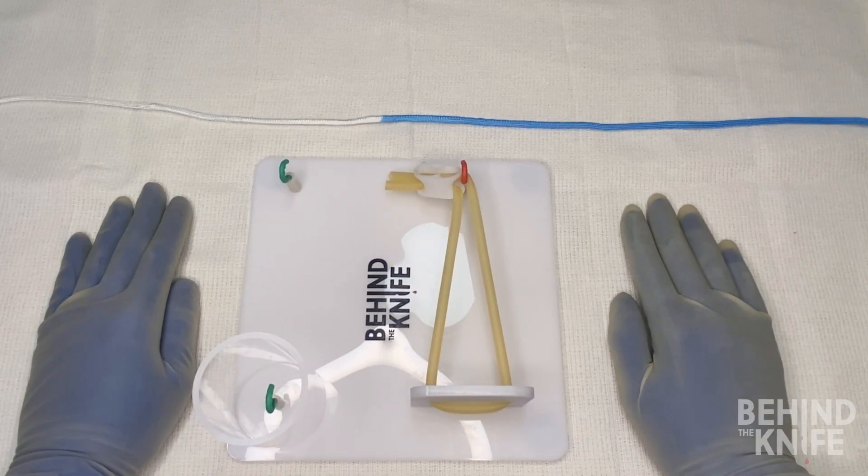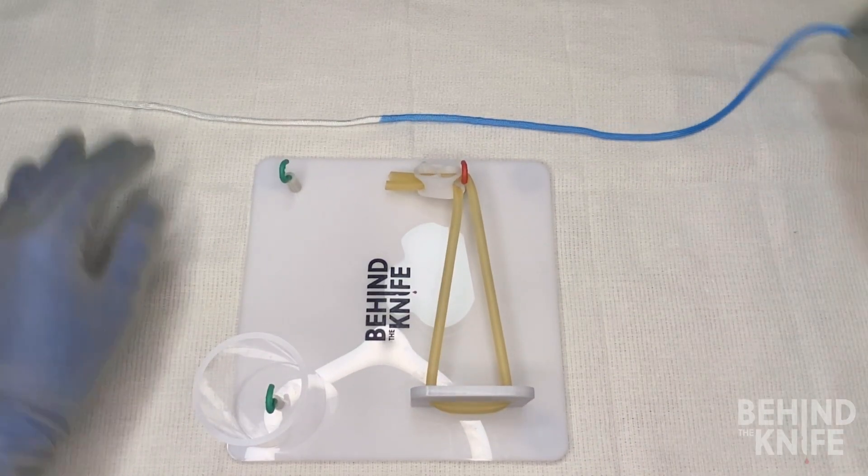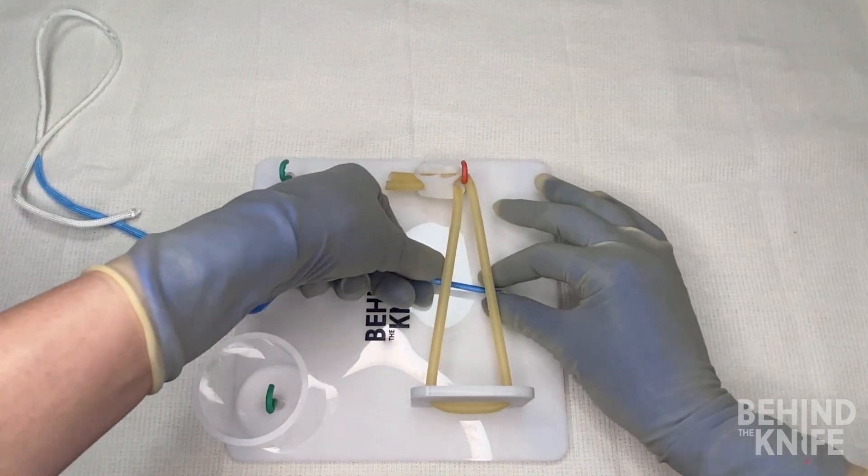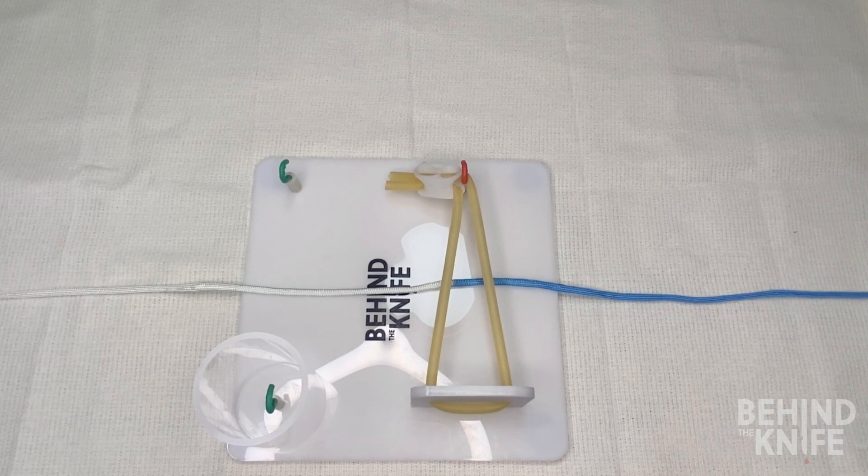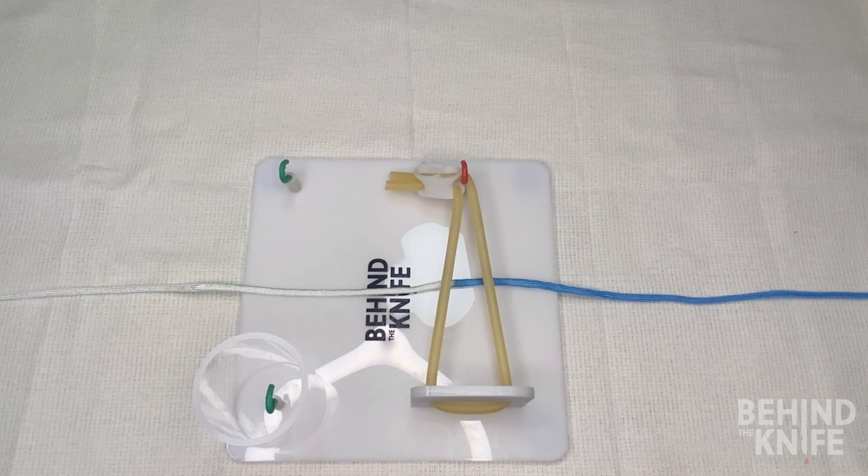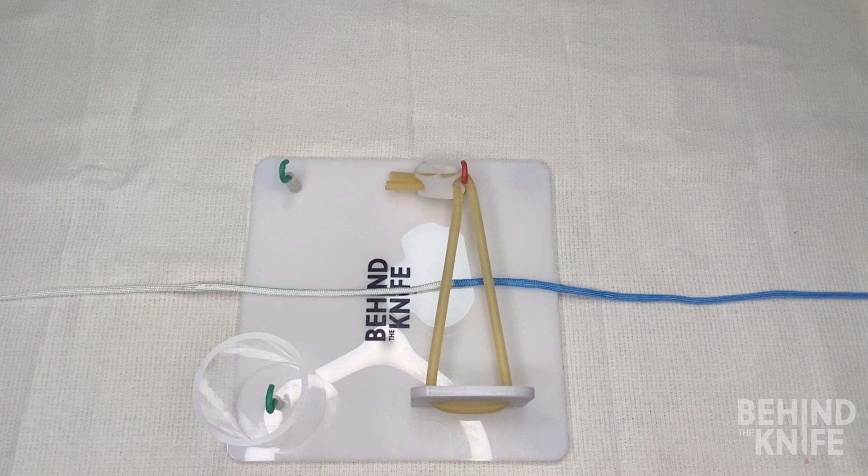So to start, we'll place our knot tying board in front of us, and we'll thread our practice string behind the side that has the Penrose drain. Now for me, I'm going to place the blue side of my string on my right side, and the white side of my string on the left side.